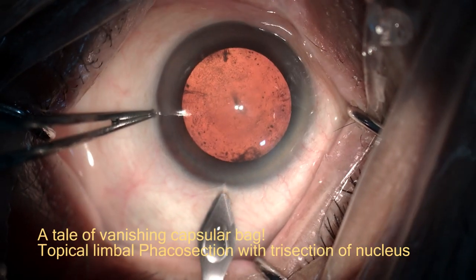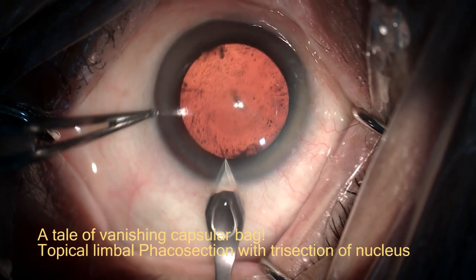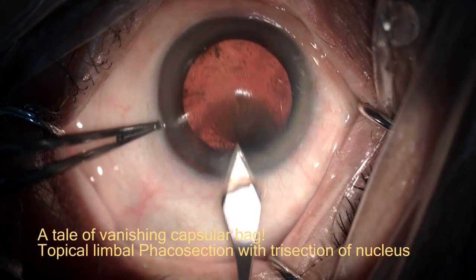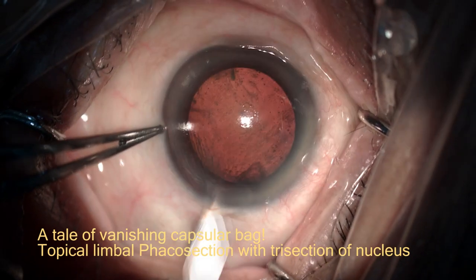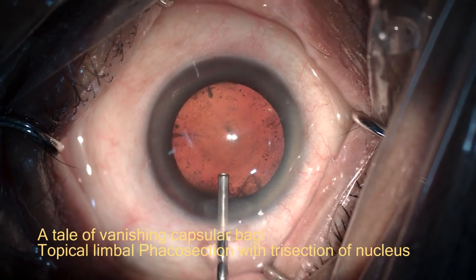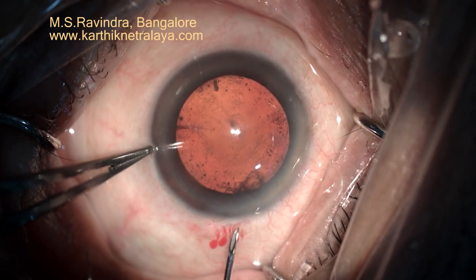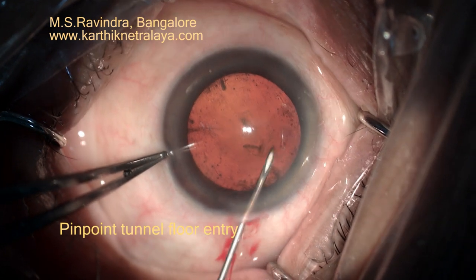A very unusual surgical presentation of the entire capsular bag vanishing for no reason. A 2.8 mm posterior limbal entry, HPMC in the anterior chamber, pinpoint tunnel floor entry, and technique of the capsulorhexis.